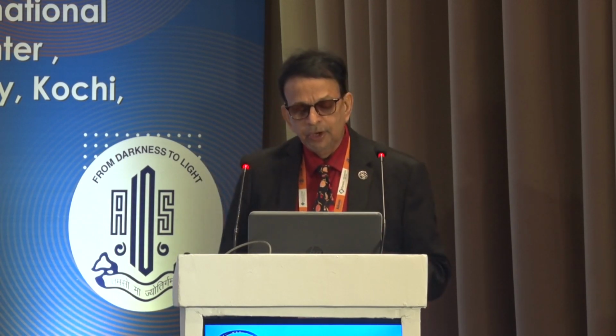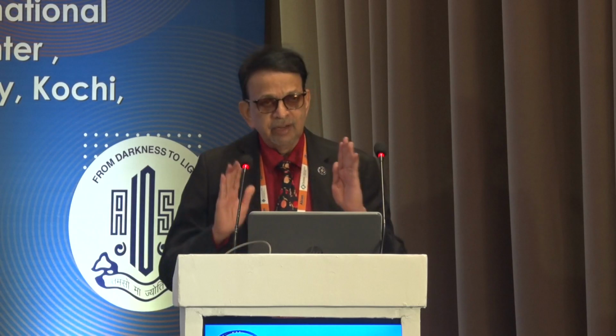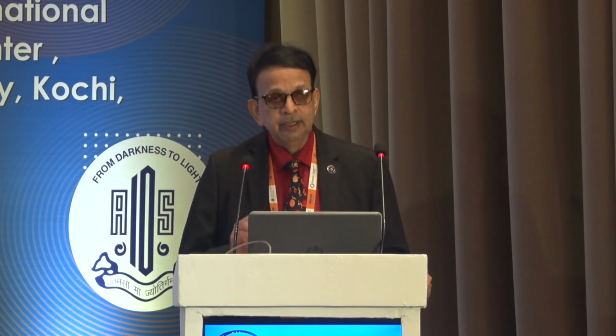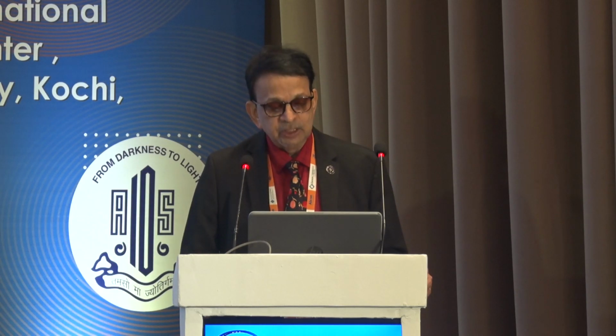So femtophaco, the advantage is that you can have consistently clear corneas, clear wounds in all these patients, and that is the biggest advantage. Just to show you a patient with again a brown cataract and also a white cataract, you can see here Argentina flag sign and type 1 intumescent cataracts. In white cataracts, the femto works wonderfully well, and you can get this consistently good rhexis and no Argentina flag sign. Only thing is, look for skip areas there. Sometimes it may not be free floating, sometimes there can be small attachments or micro attachments.